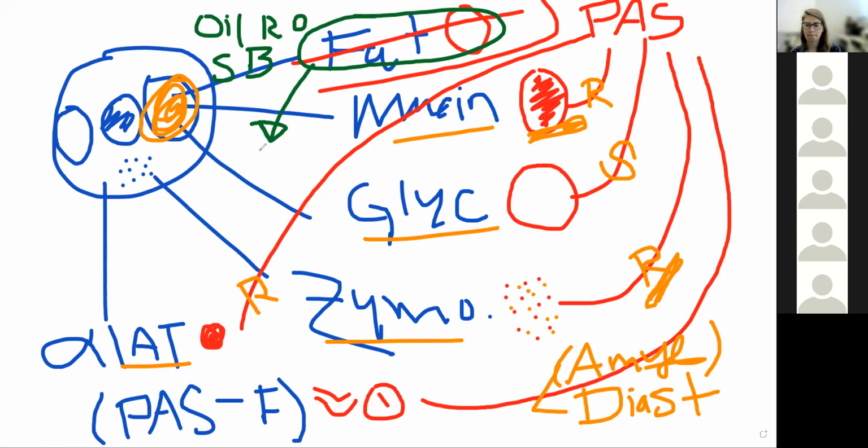The last situation I was aware of oil red O having no utility was back when we were talking about patterns of vaping associated pneumonia. There was some utility for that in cytology. But as far as surg path, I'm going to defer.